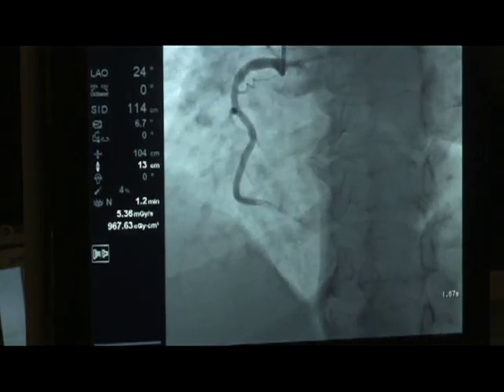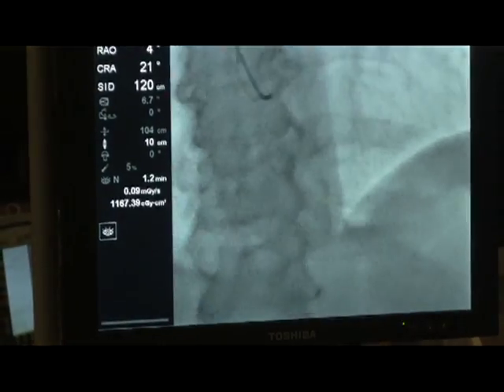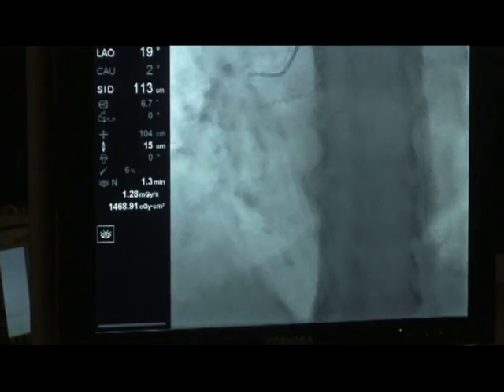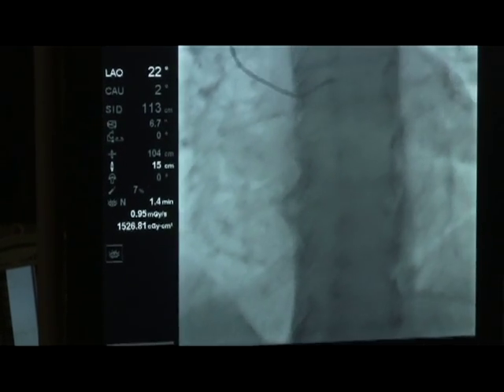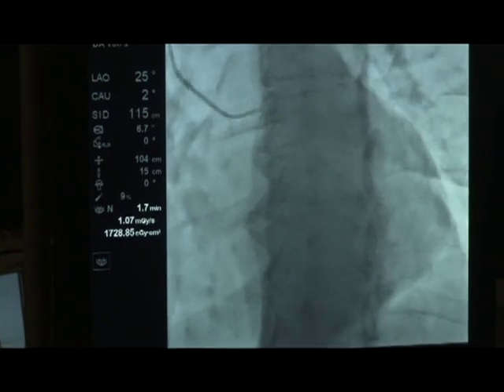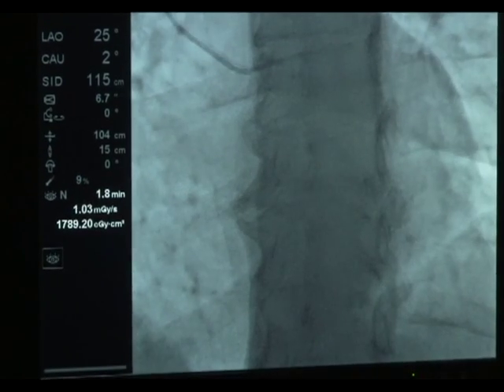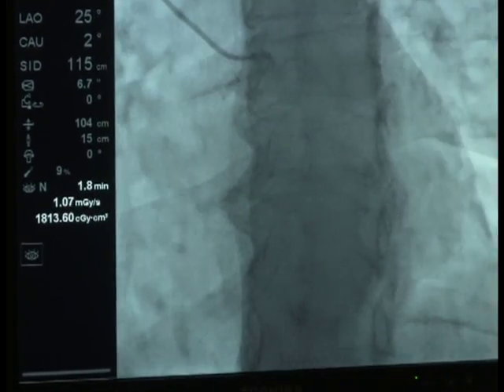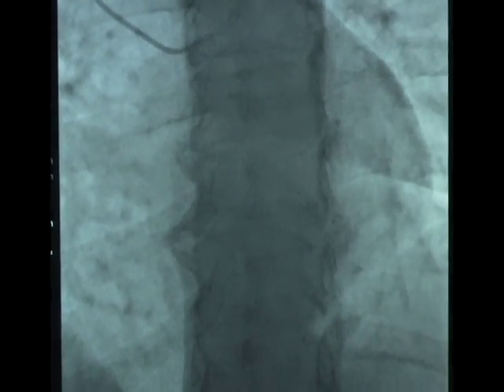Dr. Patel has cannulated the right coronary artery and we are performing angiography at this time. Dr. Patel is repositioning the catheter to the left coronary system. Dr. Patel will now perform angiography of the left coronary system. Deep respiration of the patient oftentimes facilitates placement of the catheter into the coronary cusp.